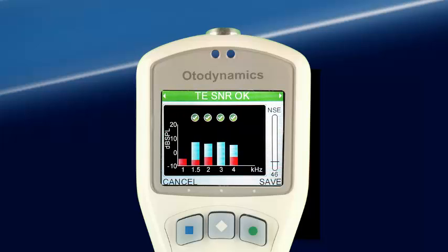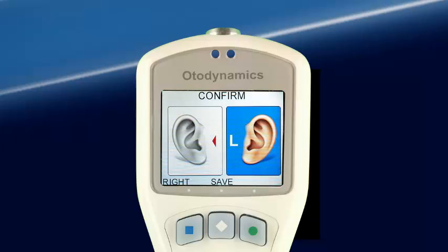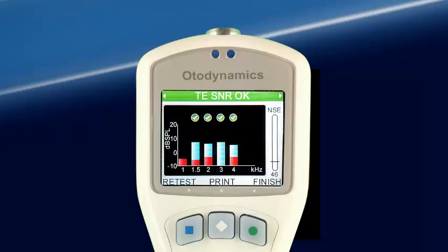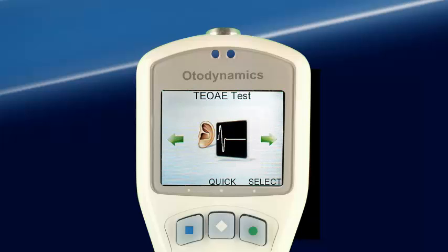Pressing OK brings up the next test screen, showing the result banner at the top and the half-octave histogram. Save allows us to choose the appropriate ear with the left-right arrow keys. Selecting Save again saves the test. Once saved, the test may be printed by selecting Print. If another test is to be performed on the same patient, Retest may be selected and the same demographic data will be used. Testing may be ended by selecting Finish, which returns us to the TE test screen.